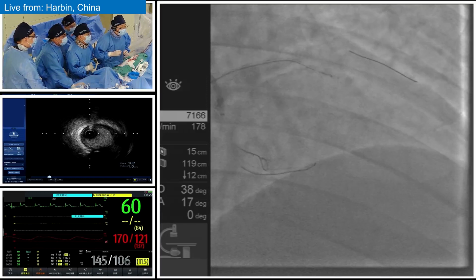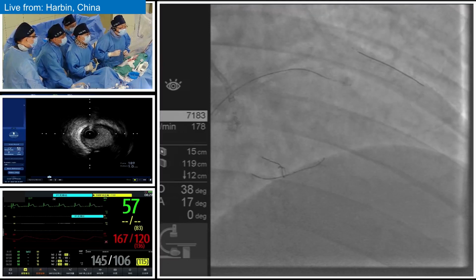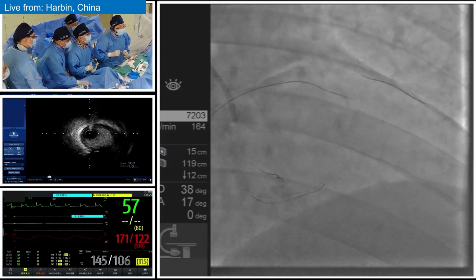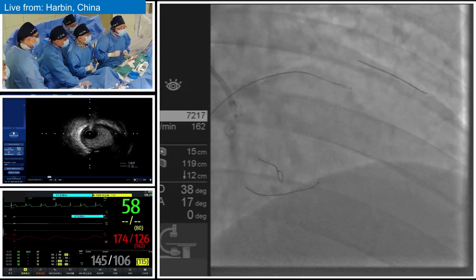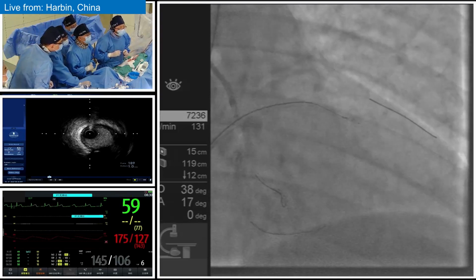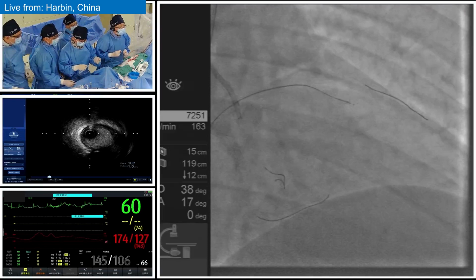So as we can see, we are using the wire to try to puncture through the vessel architecture, also within the subintimal space, to re-enter into the true lumen. The direction is very important because, with retrograde angiography and also some information that we acquire from this 3D reconstruction, the puncture direction is of key importance to the success of the following procedures.